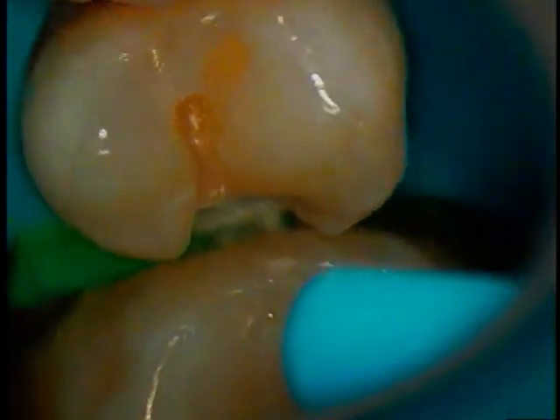Okay. Dry, please. Okay, so we're going to lower our light, and I'm going to place that Vitrebond. I'm going to bond that in first. Okay, he is isolated with the rubber dam. There is a wedge in place, and there's absolutely no sulcular fluids coming up. Plus, I'm looking with a microscope.